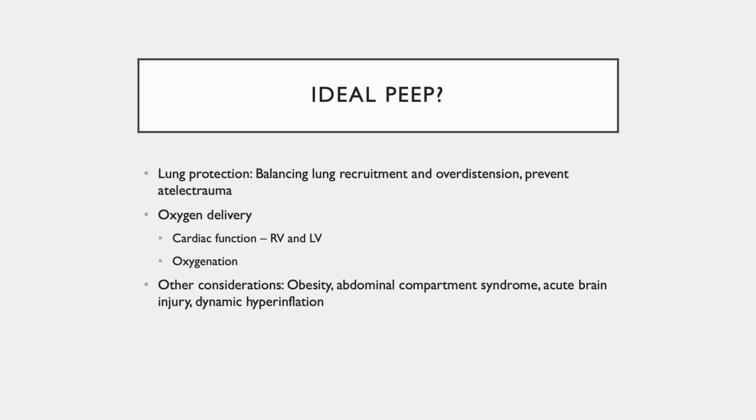To sum things up, what might we consider an ideal PEEP to be? An ideal PEEP should be one that renders lung protection by recruiting collapsed alveolar lung units to augment the baby lung without causing too much injurious over-distension, and also be set at a level that prevents tidal collapse of as many lung units as possible to avert atelectrauma.